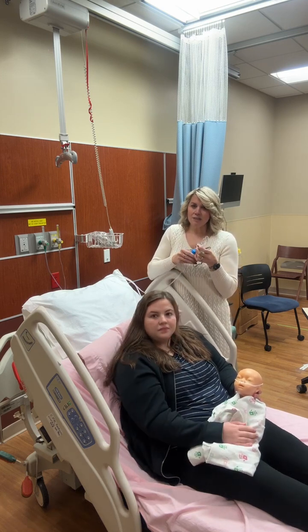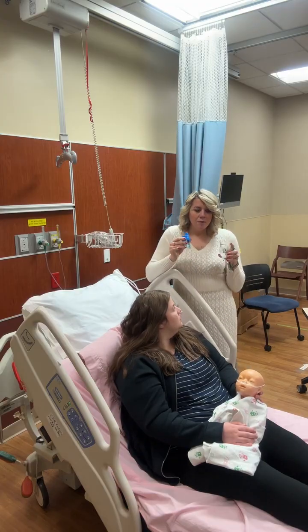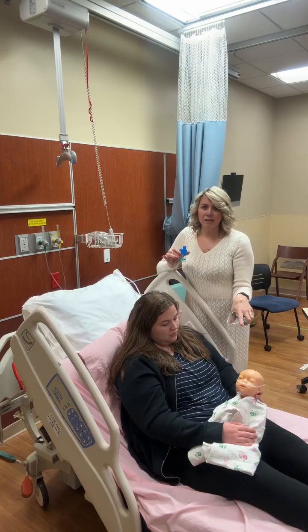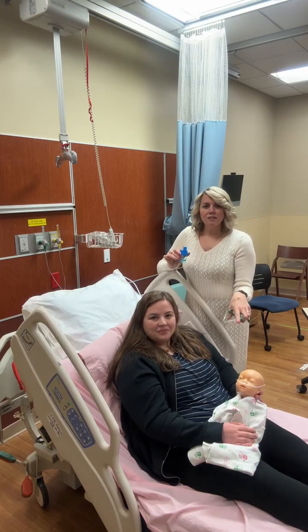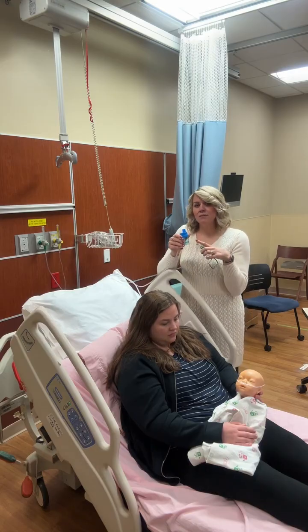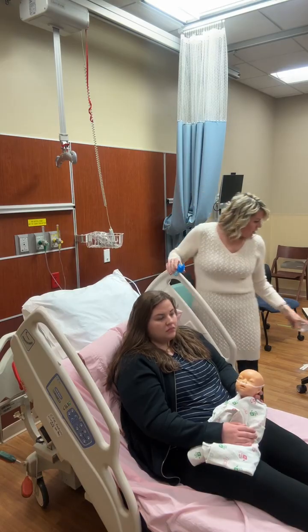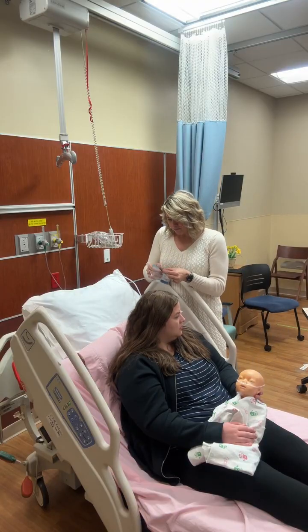And for this reason, I'm actually going to put meds in here just to show you what it does. And I'm going to show you, this is not a mechanical simulator. This is just a baby doll. So I'm not going to cause any damage to this by putting the nebulizer in front of a simulator. But I do want to tell you that in sim, again, as a reminder, we will never put meds in the cup during your scenario. But for this situation, I want to show you something.